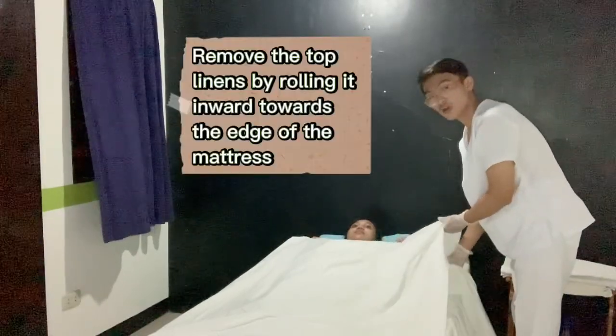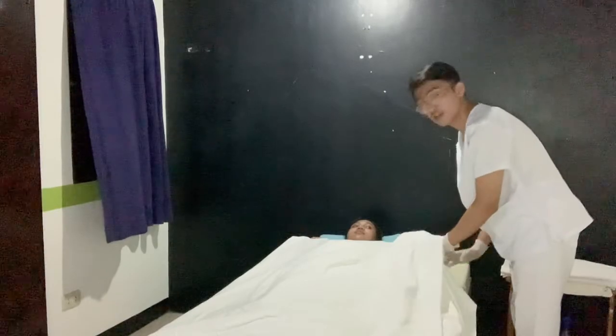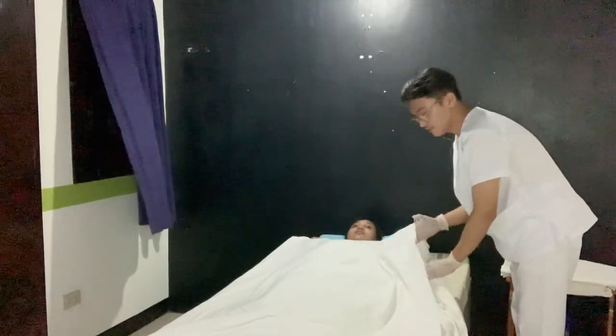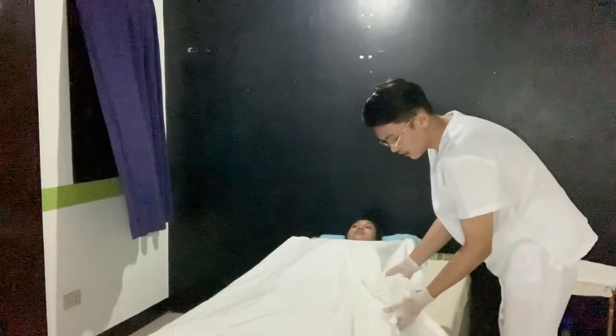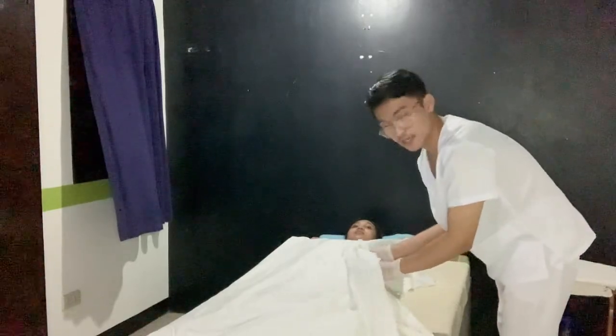Now remove the top soiled linens by rolling them inwards towards the edge of the mattress. By rolling it, it can prevent the harboring or scattering of secretions and microorganisms.